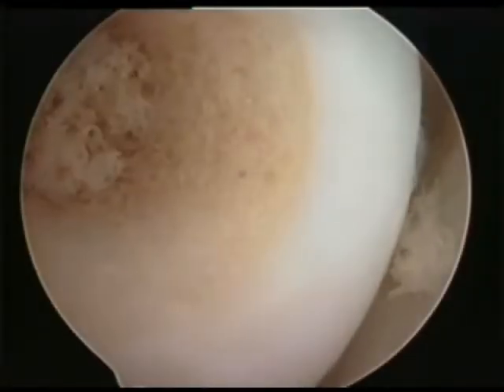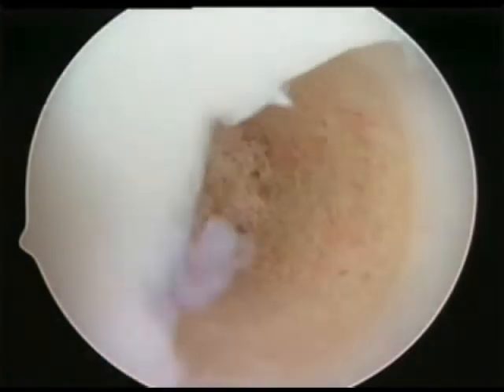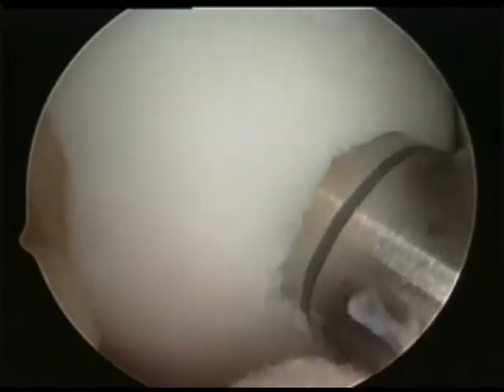Using a calibrated Oates alignment stick of the appropriate diameter, measure the recipient socket depth and align the angle of the recipient socket in relation to the position of the insertion portal.